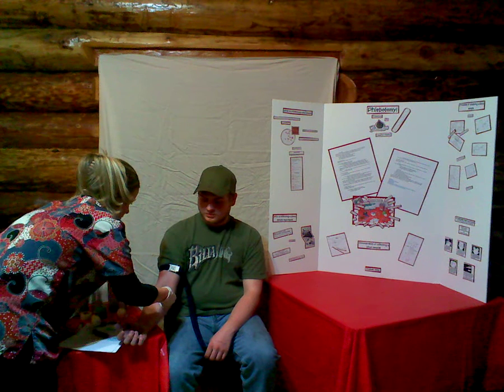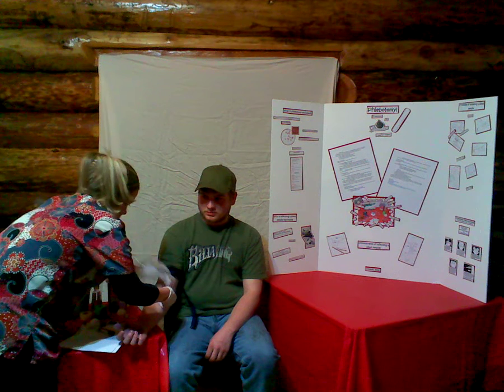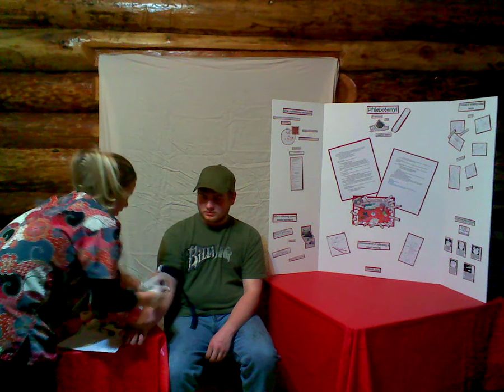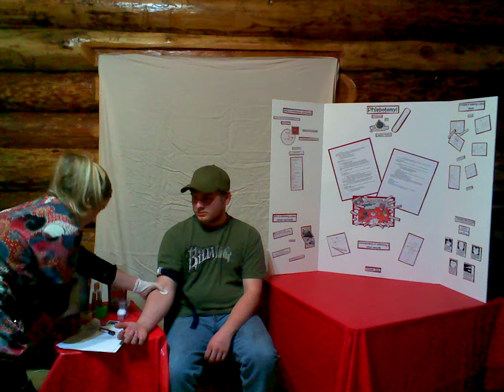And I'll remove my tube, release the tourniquet, use cotton ball and pressure, dispose of my sharps.